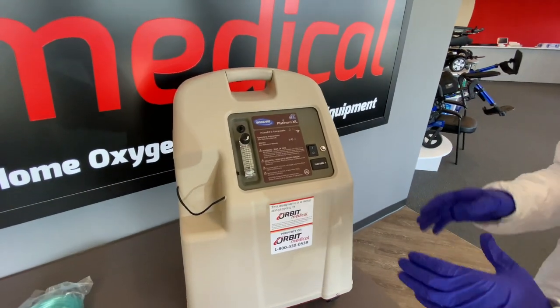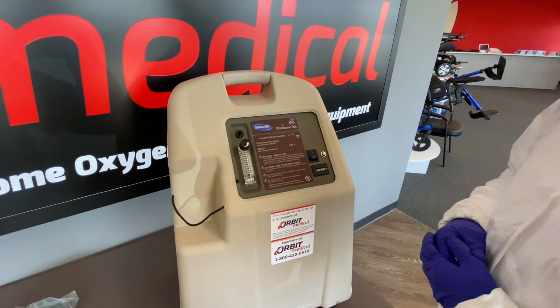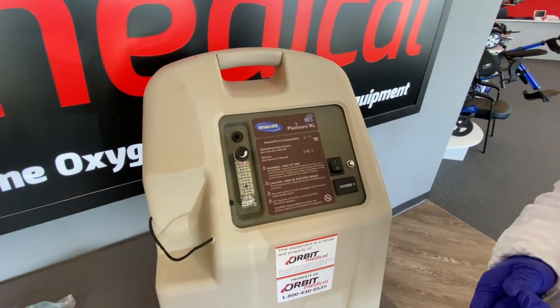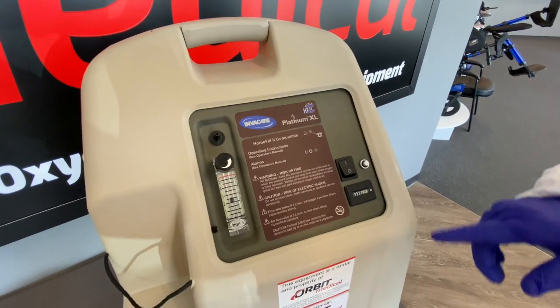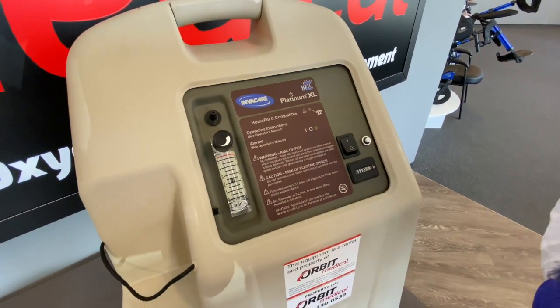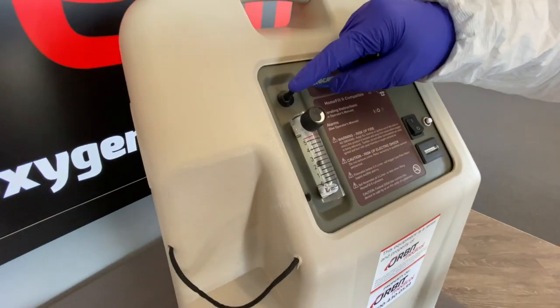The concentrator has a power toggle right here to the right. I'm going to go ahead and turn it on — the initial boot-up time is about 30 seconds. Right next to that power toggle there's a reset button. This reset button will be required to be pushed in if there is a power outage.